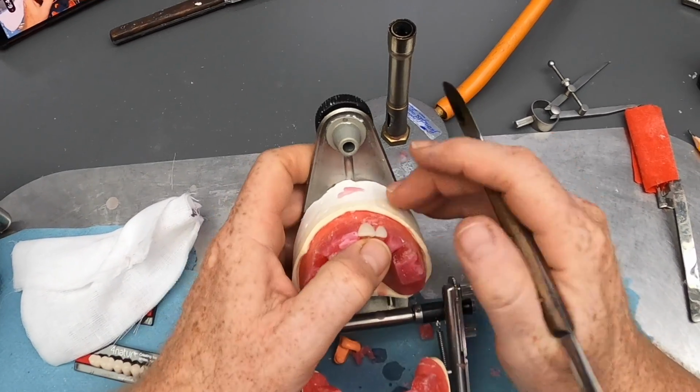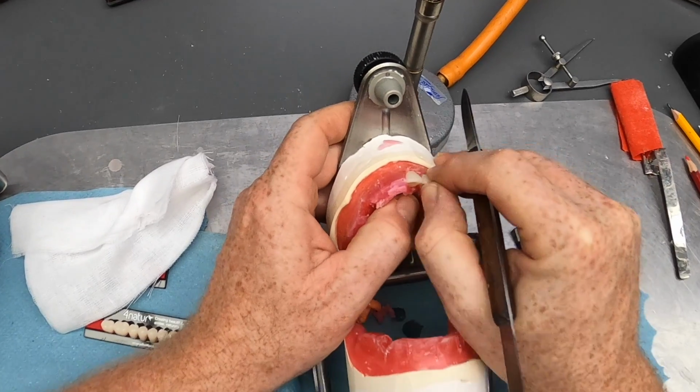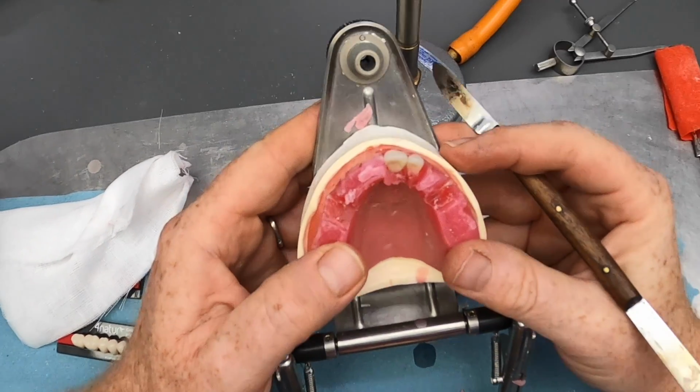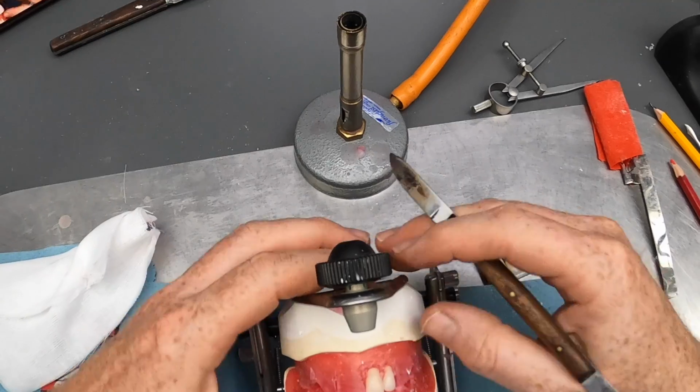And we're starting to work our way around the arch. I want to just check that we're following that arch form, so I just want to rotate mine very slightly until we've got something like this. Okay.